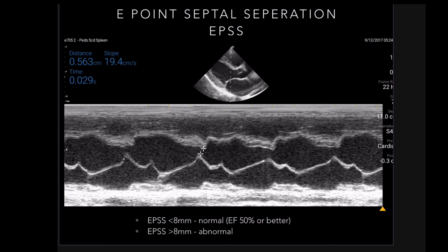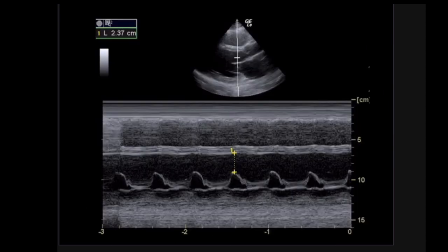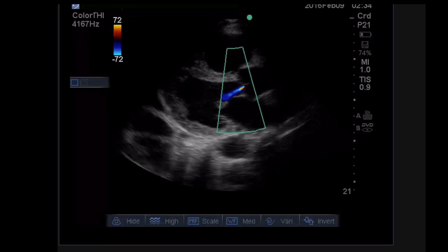There is actually a formula to estimate ejection fraction from the exact EPSS measurement. The big problem with EPSS is there are many reasons you might have a normal LV but an abnormal EPSS. Here's a patient with obviously bad aortic regurgitation — the AR jet is perfectly timed to hit the mitral valve leaflet as it's trying to open, blowing the leaflet down. Any aortic or mitral valve pathology will give you an abnormal EPSS number even if it has nothing to do with LV function.